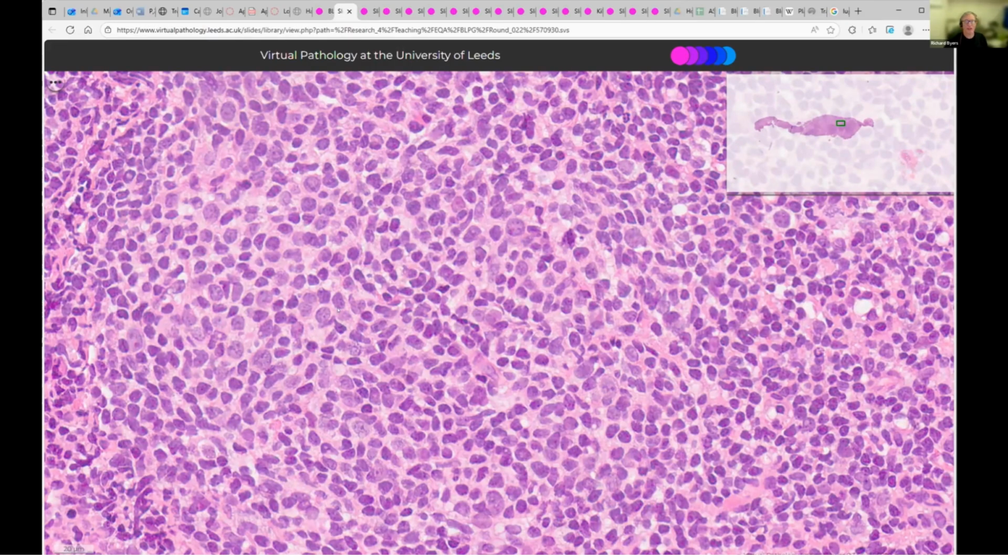I always think they look like scrunched up bits of paper. So they've got a long axis and they've got little folds in them. And that's how I think of centrocytes, elongated with folds along the nuclei, like scrunched up bits of paper. I've got a very simple mind.